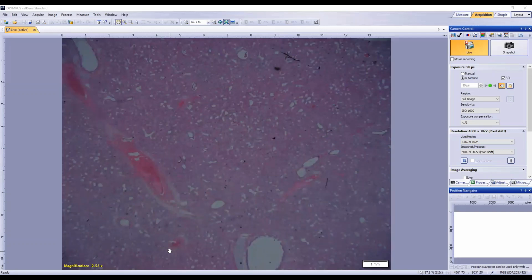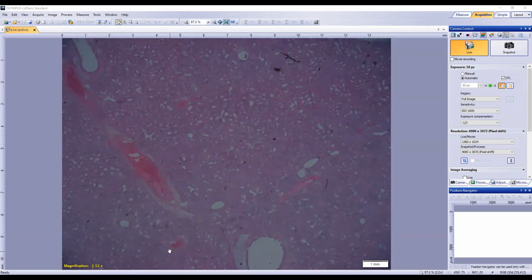The other smaller tubular structures that are just at 12 of the bronchus, forming a straight line, my guess would be that they're probably bronchioli. Yes, exactly. Well, the big blood vessels that the other colleague mentioned before look more like arterioles or arteries. Yeah, exactly. Good.